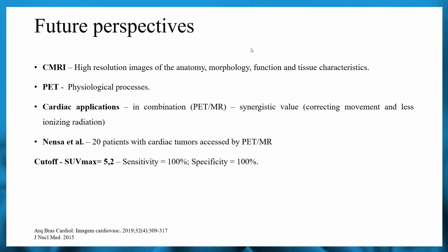For cardiac applications, in combination, the PET-MR may show a synergistic value, correcting movement and exposing the patient to less ionizing radiation.